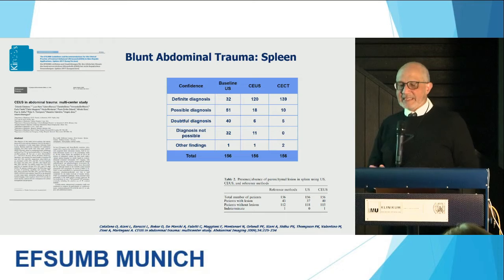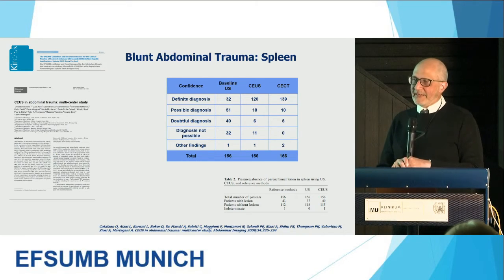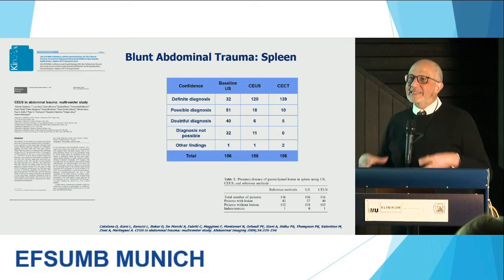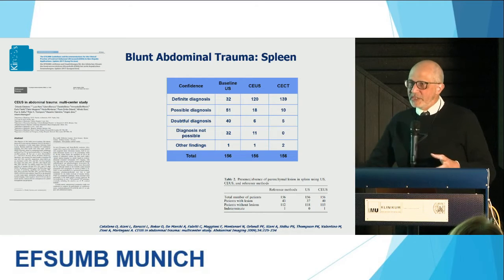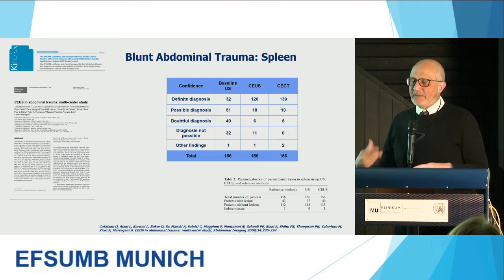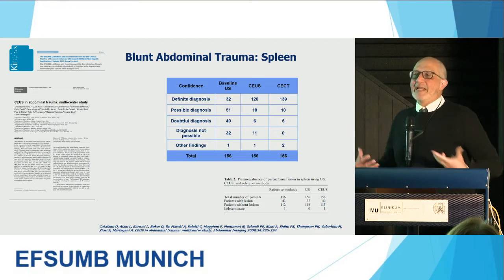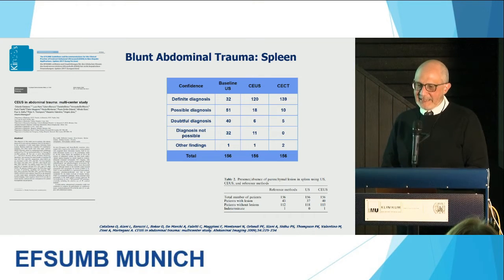So this specific study was to see if you could improve on your baseline ultrasound examination of the solid organs, not FAST scanning, but extending it to solid organs, making it easy so you could just image the solid organs. So the study was set up with 2 doses. You gave 1 dose to look at the right kidney, a second dose to look at the left kidney, and then at leisure, you looked at the liver and spleen because you had enough contrast going around, and then they had a CT scan.